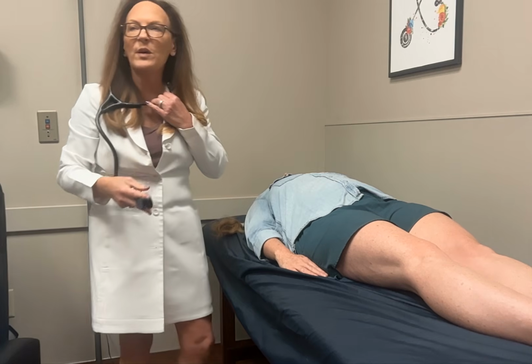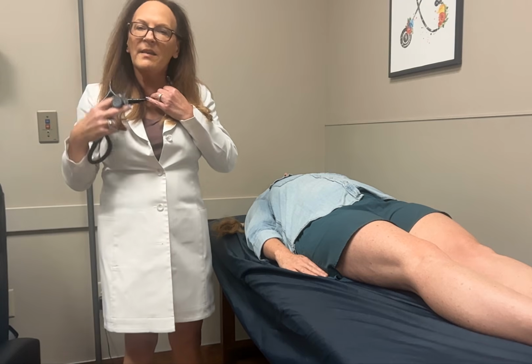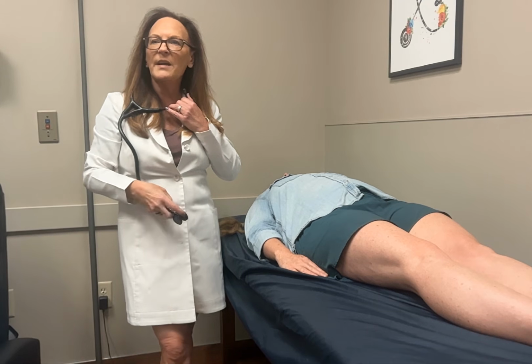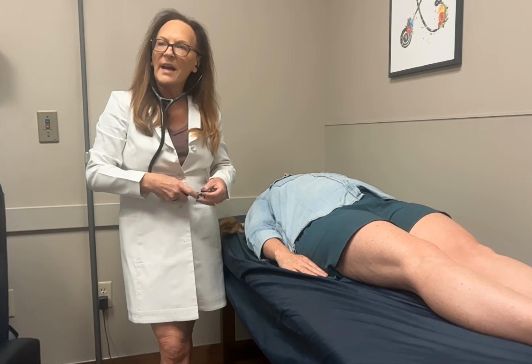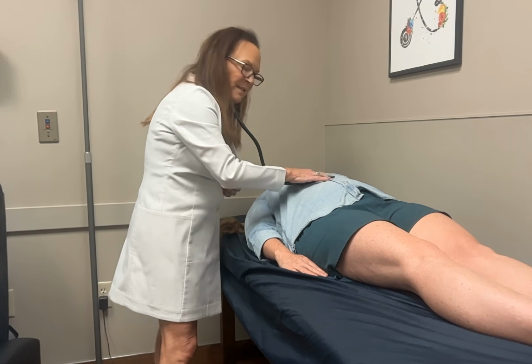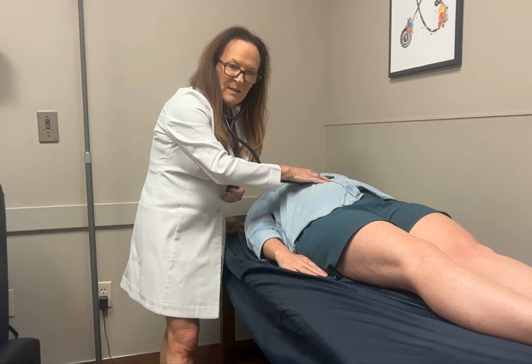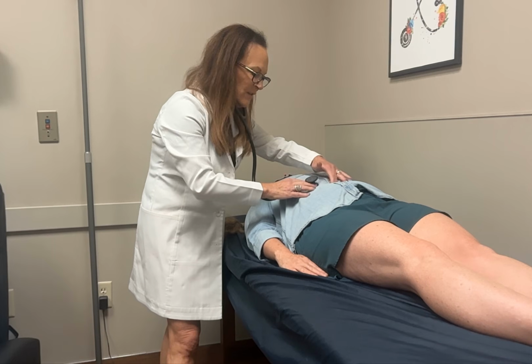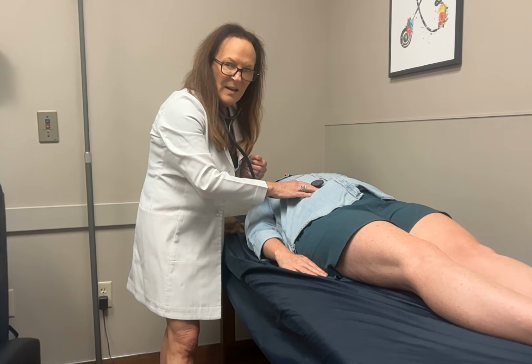And bowel sounds are present in all 4 quarters. The next thing I'm going to do is auscultate for bruits with the bell, and I'm going to check the aortic, which is midline below the xiphoid process. The next I'm going to do is the left renal, which is above and lateral to the umbilicus, so you can find the umbilicus and check that.